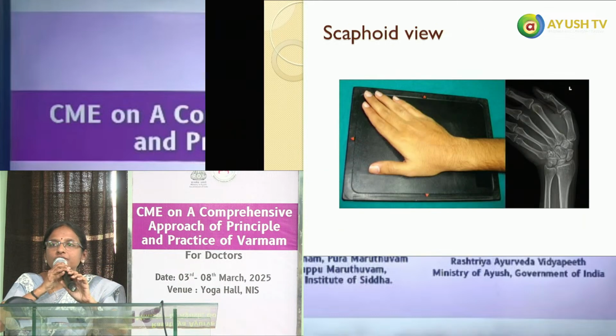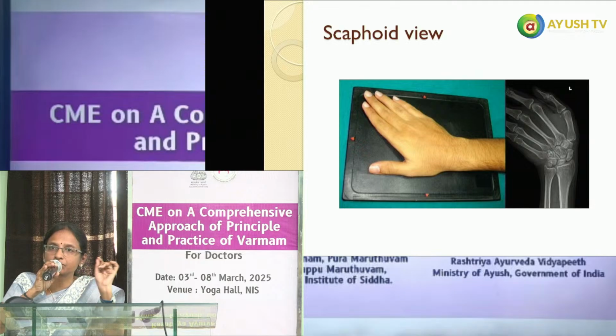இது வந்து scaphoid view. See scaphoid na ரொம்ப common. Metacarpals and carpals bone la most common to be fractured will be the scaphoid bone. But என்ன problem na routine எடுக்கிற PA view ல வந்து scaphoid bone fractures are sometimes missed. So அதுக்கு என்ன பண்ணலாம்னா posteroanterior view with the ulnar deviation.